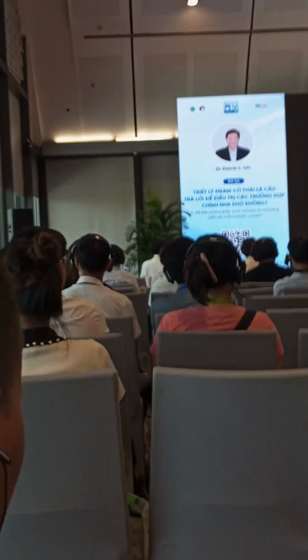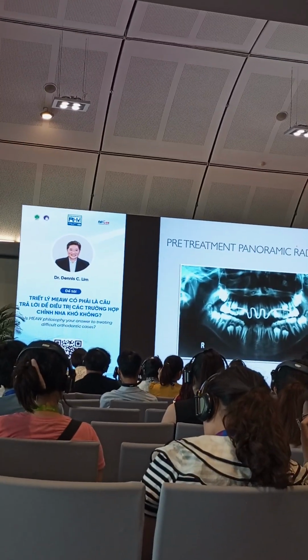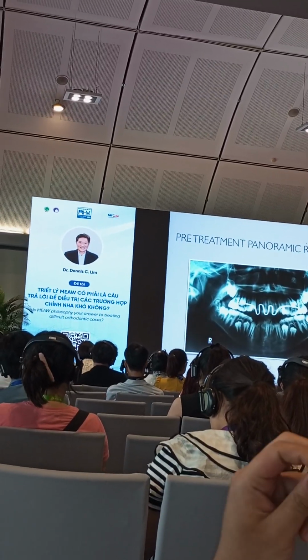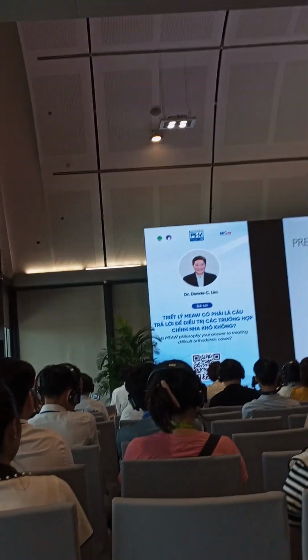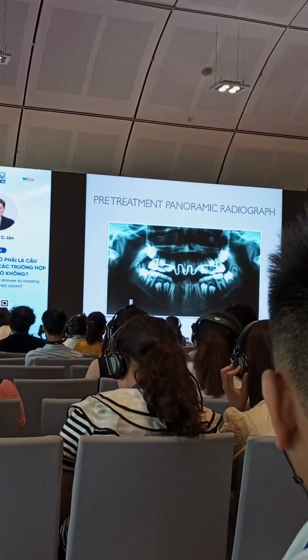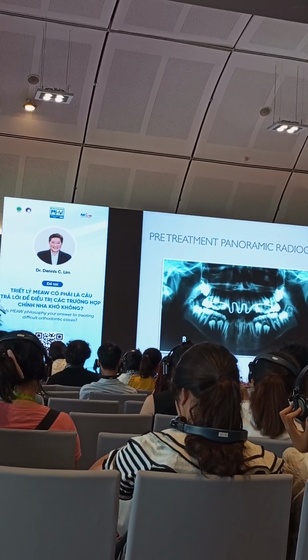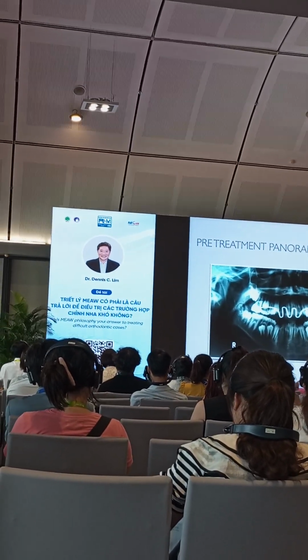So when we install the meaw wire, we continuously give elastics to the patient, asking the patient to wear the vertical elastics. She's not wearing. She keeps on telling us, yes, she's wearing, but you can see that she is not wearing it. How? Because when I asked the patient to wear the elastics, she had difficulty placing it unless she looked at the mirror. If you are a compliant patient, you can place the elastic without looking at the mirror, because you regularly wear it. But she cannot. She has to ask for a mirror and she has difficulty placing the elastic. It means that she's lying.